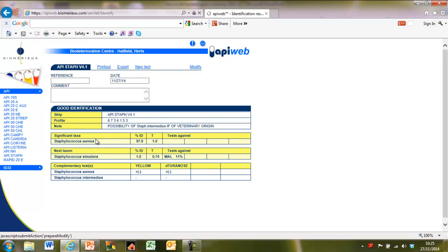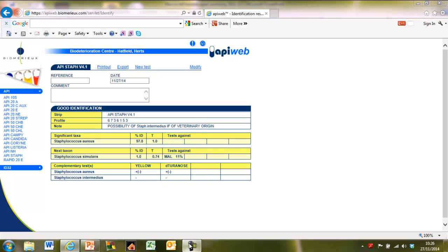We can see that we've got a good identification. The organism has been identified as Staphylococcus aureus with a percentage certainty of 97.8% — a very good identification. The next most likely organism is only 1% certainty, which is Staphylococcus simulans. We'd be happy to report that as an accurate identification. That's a brief description of how we may go on to identify a microorganism in the laboratory.